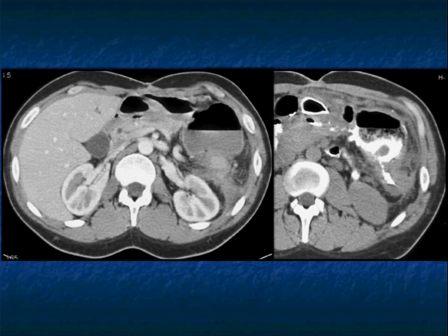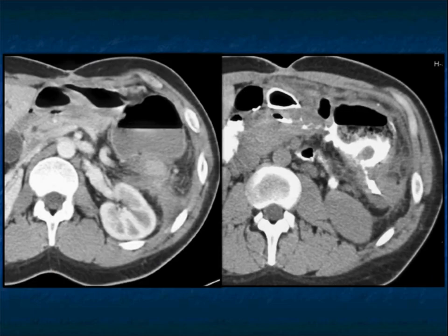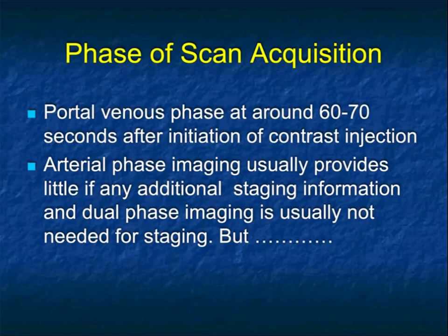And we know this anytime we're looking for a fistula, whether it's colon to bowel, or colon to vagina, or colon to colon, or small bowel to colon, positive contrast is the ideal agent for defining fistulae. And we talk about that also when we look at ulcerations.